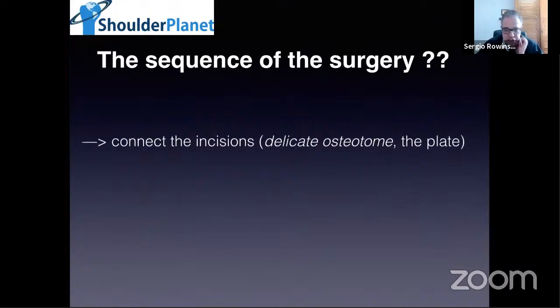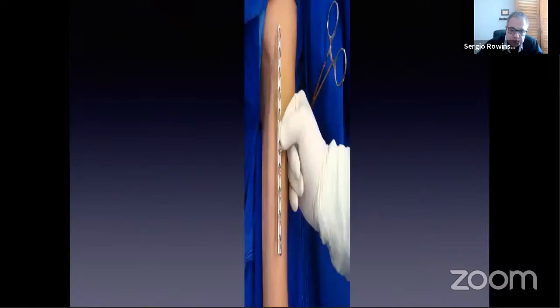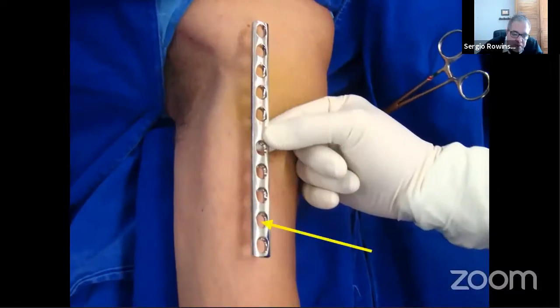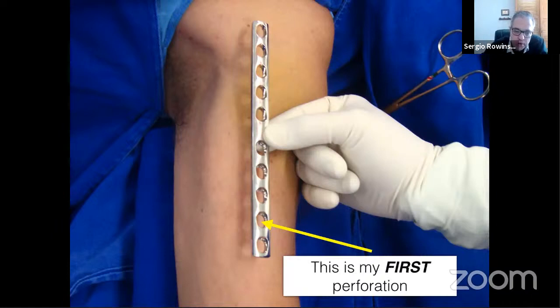I connect the incisions, and a good tip is that the plate works as a delicate instrument, like an osteotome, but it's blunt, to connect the incisions, always under traction. And this is how I start. I always start with this hole, which is the penultimate screw, and I don't do it through the plate. I mark the incision, the place, if necessary under C-arm guidance, and I do the perforation absolutely anterior without the plate.